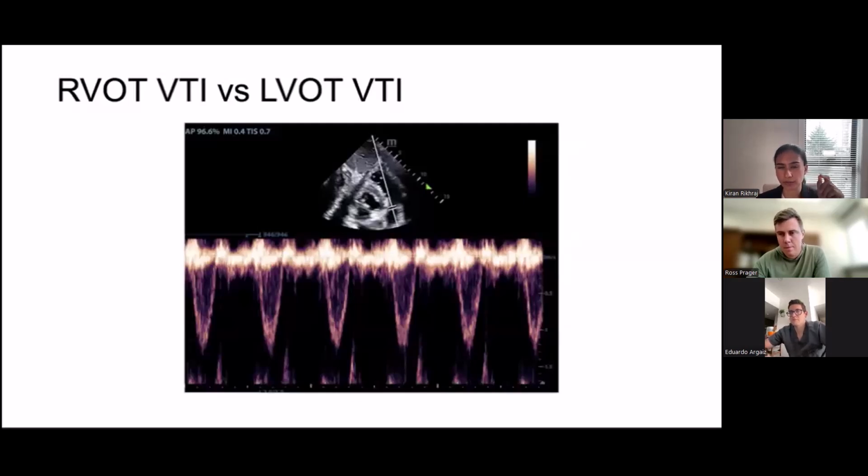And so usually the number that I have in my mind for an RVOT VTI is about 14 to 16 centimeters. And you measure that number, you use that same hypothesis generation approach to an abnormal VTI, and then you track your changes in your number. So I really like this as a strategy for transthoracic ultrasound if I'm unable to get an LVOT VTI.